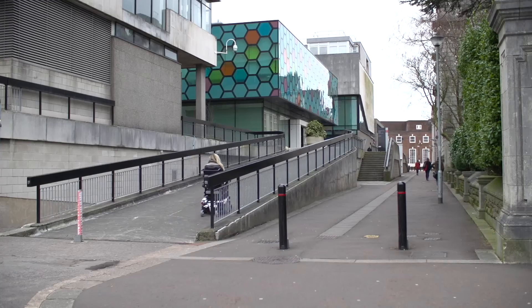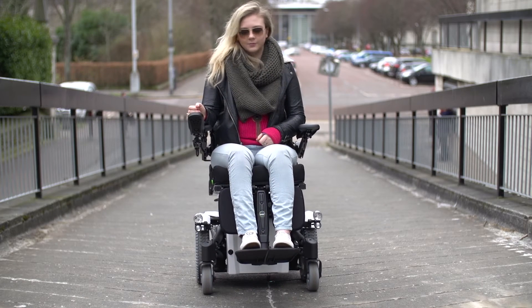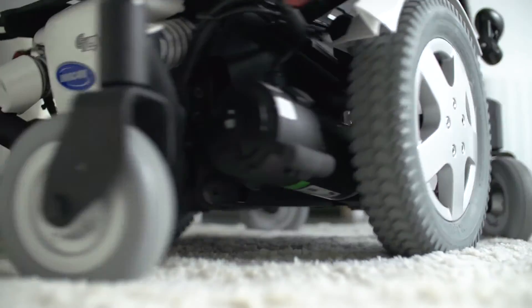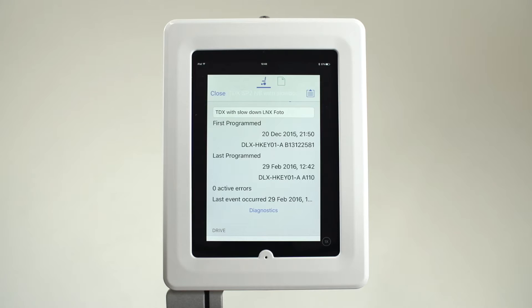It also allows the user to drive with confidence on any surface, camber, or incline, with improved hold on slopes, and reduces the effect of caster lock on soft surfaces, keeping both speed and direction constant.